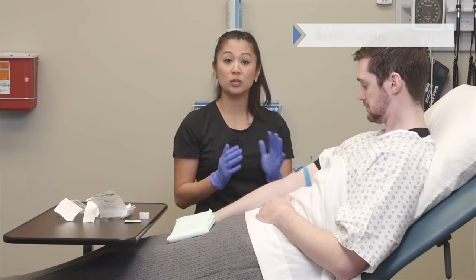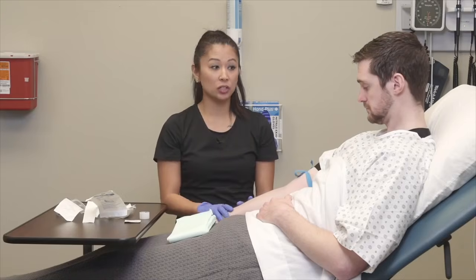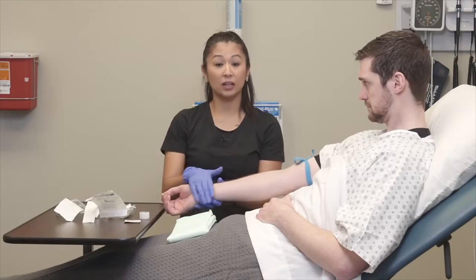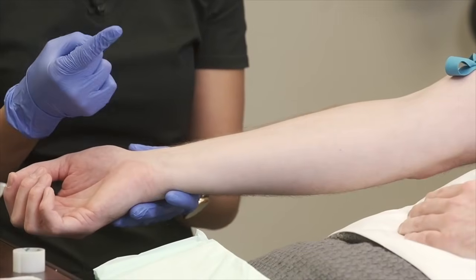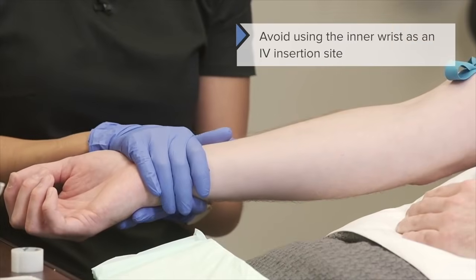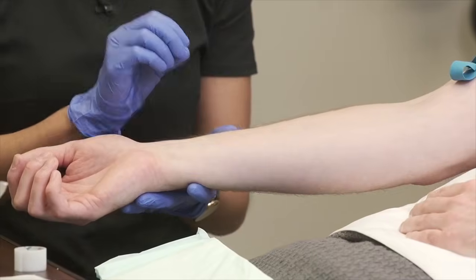This is a good time to really make a decision on where we want to go before we stick. Now, when we're looking at our patient's arm and we're choosing a site, one thing to remember, you do not want to stick on the inner wrist of a patient. The reason why is this is very uncomfortable and there's a lot of nerves. There's some very tempting veins here for sure, but this is a high risk area of really causing some sort of nerve damage for your patient. So try to avoid the inner wrist if possible.